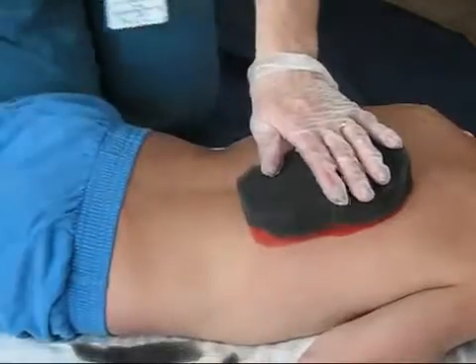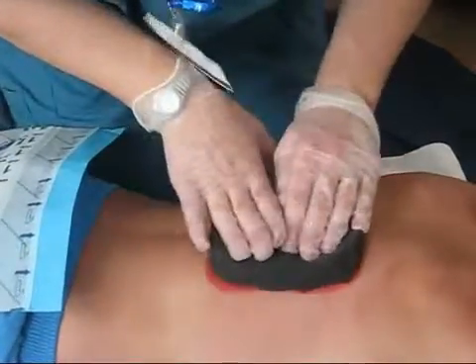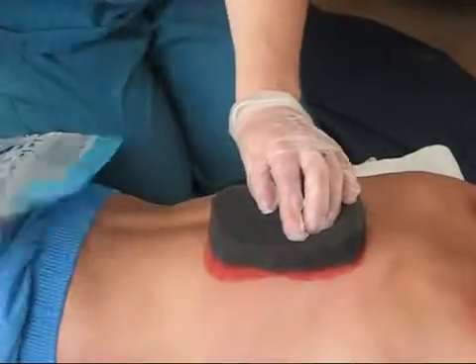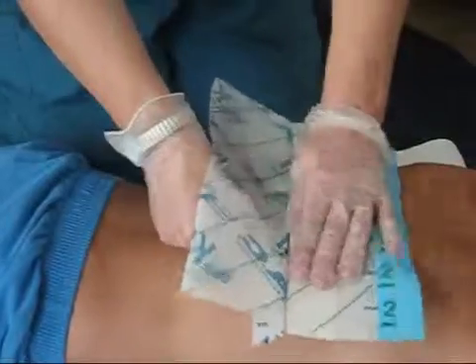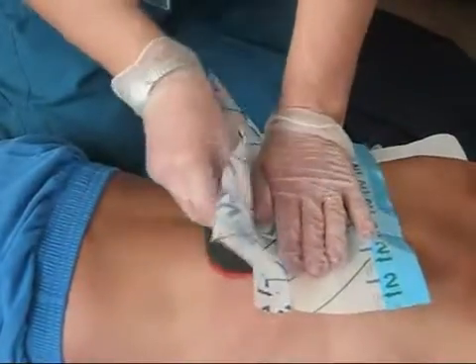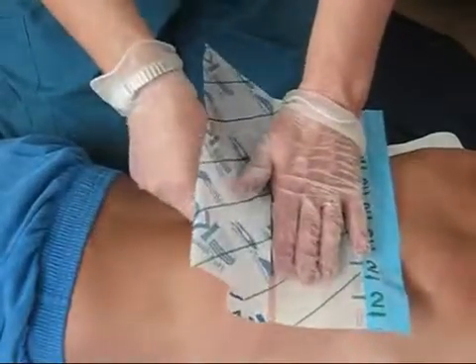Place it on. Once you have made the sponge fit as exact as possible, hold it in place, and then get your drape. Okay, once you have the sponge to fit the wound as closely as possible, then get your drape and place it over the wound.